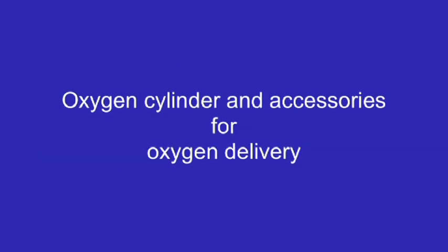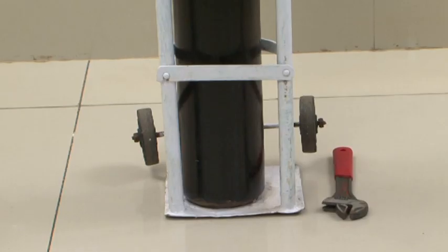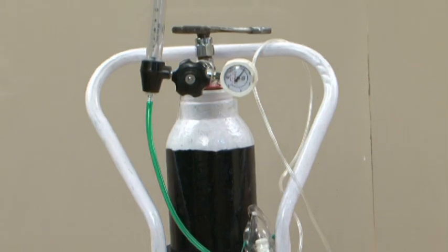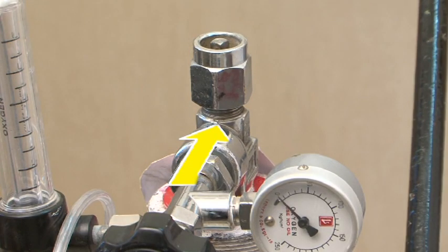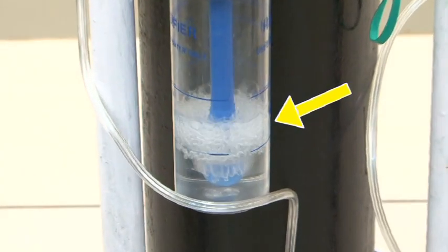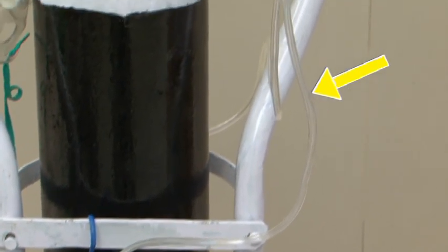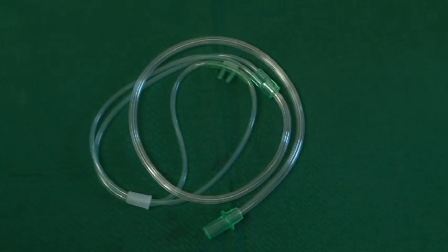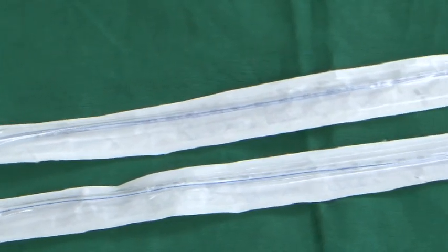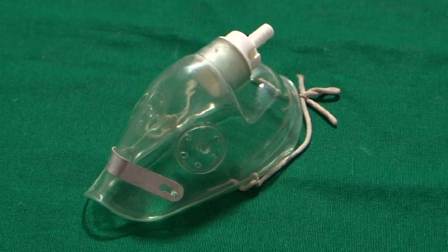Oxygen cylinder and accessories for oxygen delivery. Oxygen cylinder with trolley and spanner. Regulator, pressure gauge or flow meter. Humidifier bottle with distilled water. Tubings. Nasal prongs, nasal catheters, head box, face mask, stopwatch.